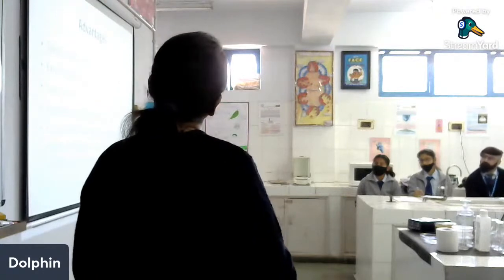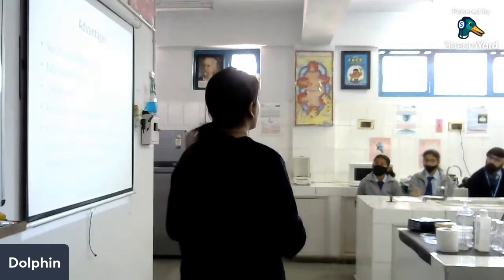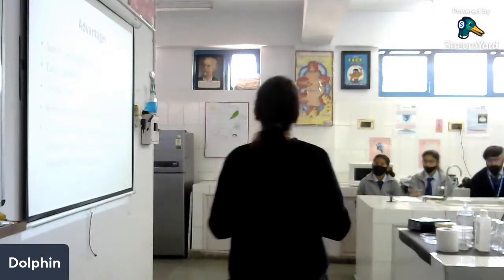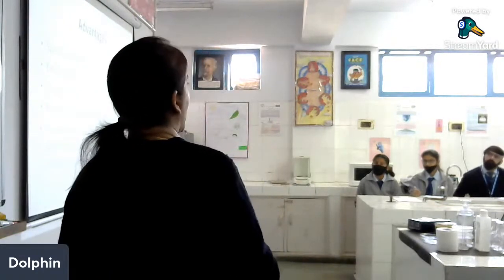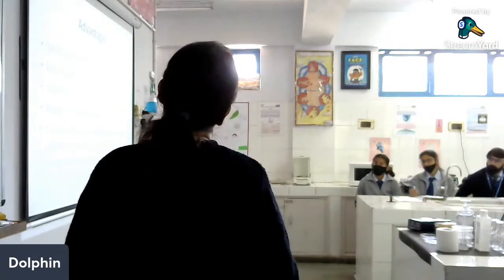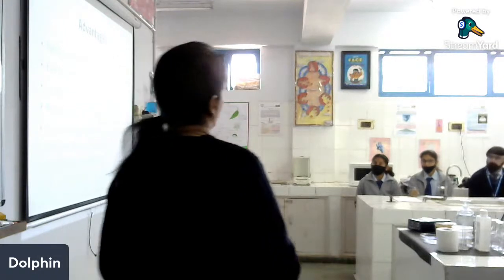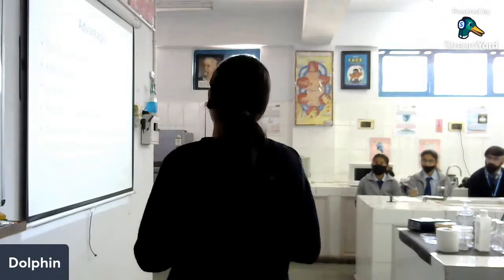And another advantage is that if your sample is not pure, doesn't contain only one antigen, each antigen will interact differently with the antibodies. So it can also separate a mixture of antigens. If you don't have a pure sample, you can also test whether your sample is pure. You can get more number of bands if there are more number of antigens present in the sample. So if a large number of antigens are present, each antigen-antibody reaction will give rise to a separate line or a separate band of precipitation. So these are the advantages of the immunodiffusion reactions.